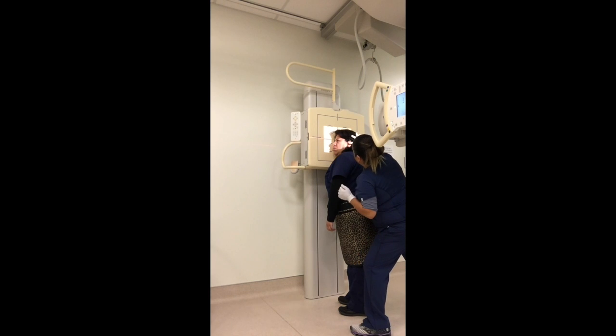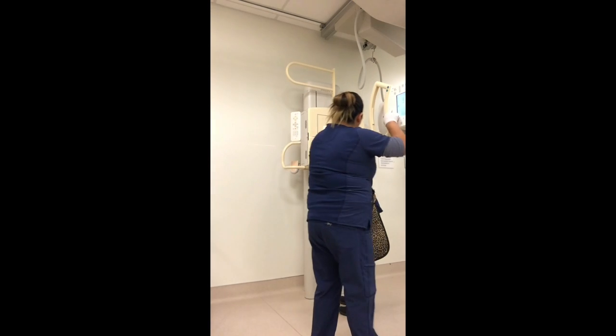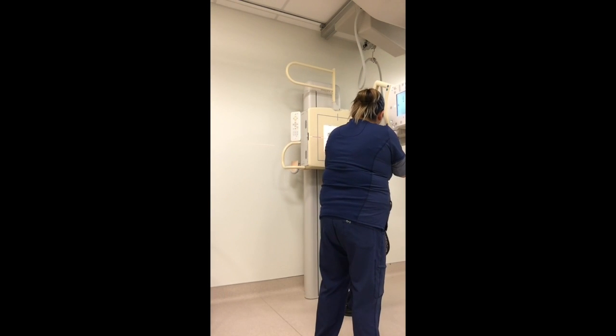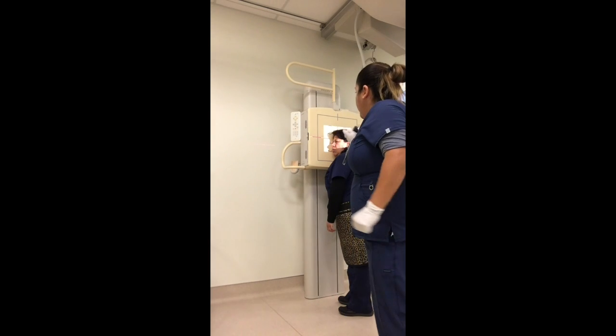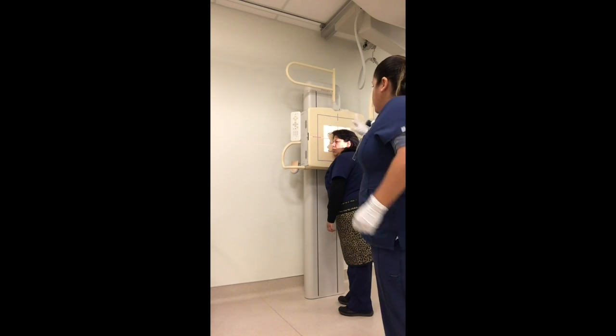And the central ray is going to be 2 inches above her EAM. And I have my IR crosswise, 10 by 12.